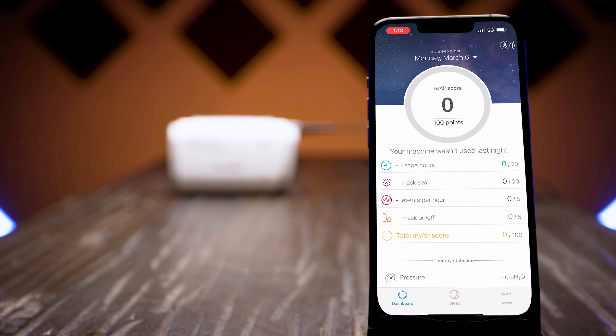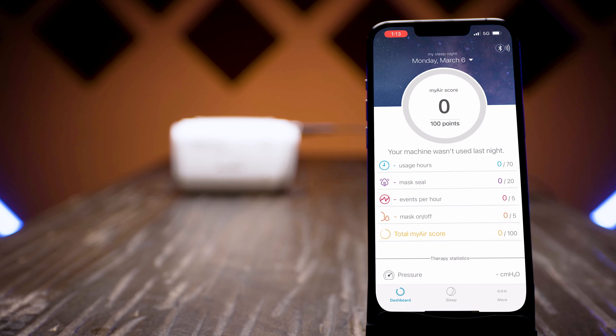So to change your settings or view your data, you have to use a smartphone connected via Bluetooth. Once your phone is connected, you can see your data on the app, which gives you a nice overview with important things like your usage, AHI, leak rates, etc. So far, that's fine. Most apps give only this kind of high-level data.